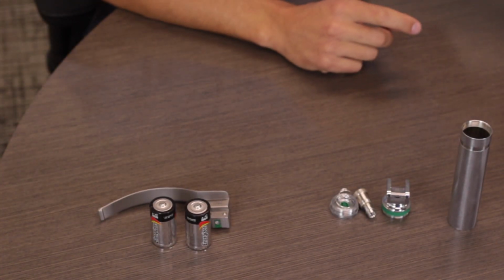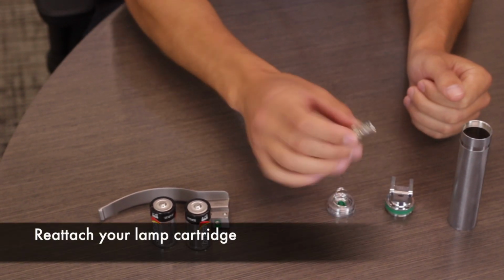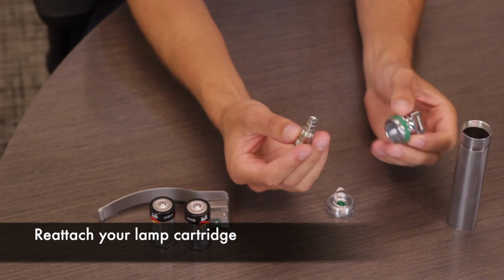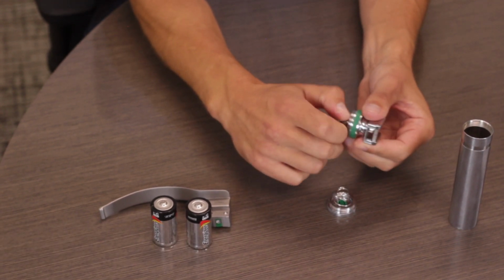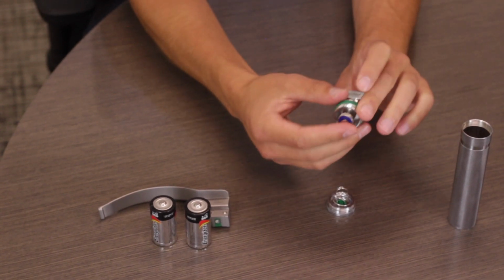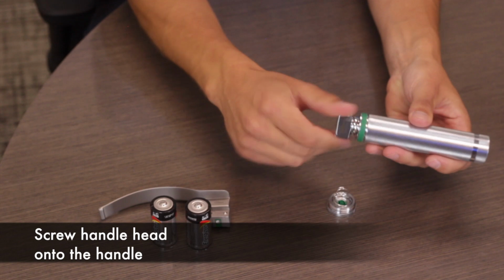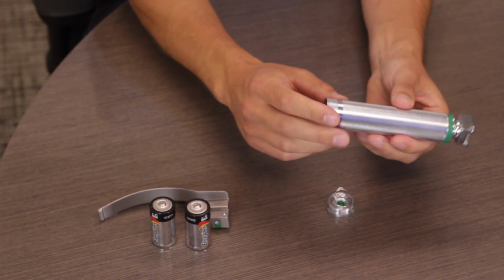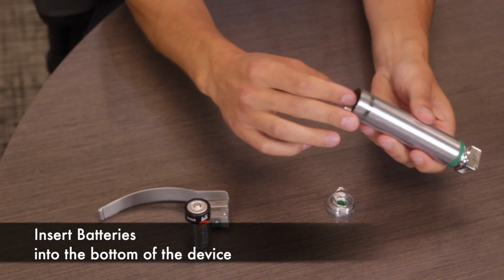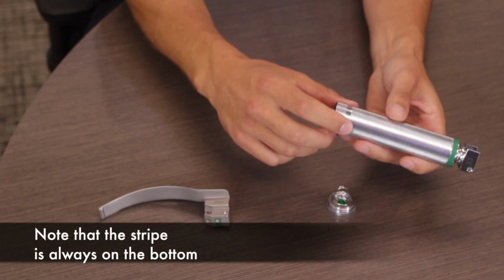Once you've completed the sterilization and cleaning process, the device is ready to be reassembled. First step is to take your lamp cartridge, reinsert it into the handle head, and tighten until it is snug. Note that no special tool is needed for this. Next, you retighten it onto the laryngoscope handle until it is snug, and then reinsert both batteries at the bottom of the device. Note that the stripe is always at the bottom of the laryngoscope handle.